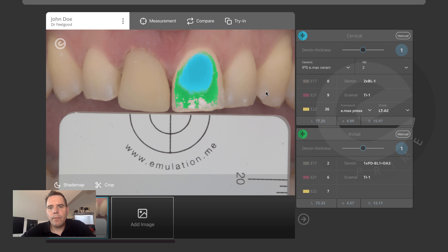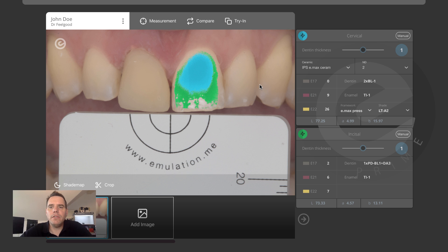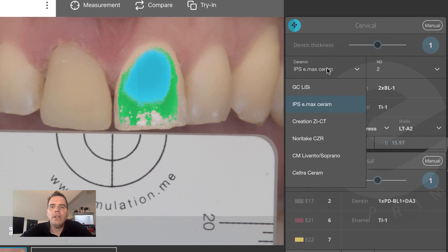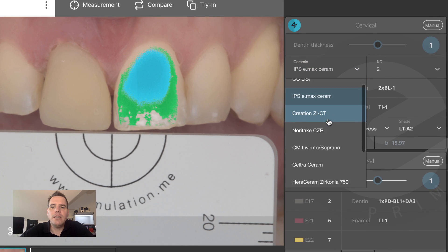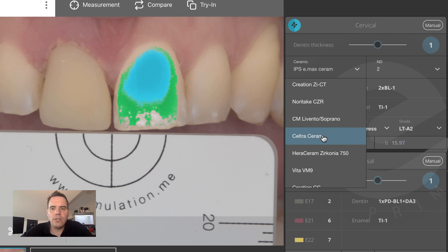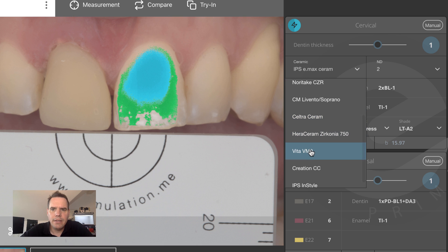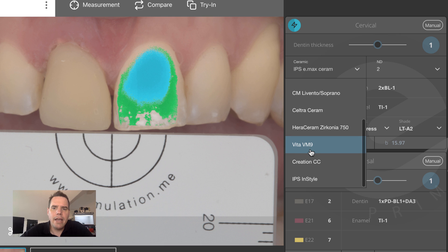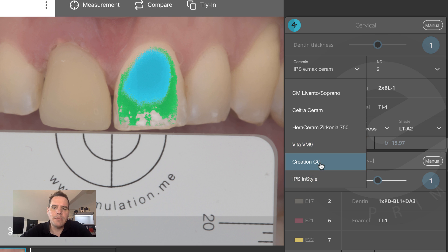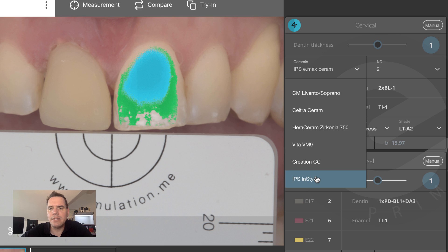So what's new in Prime? What is new in this version? Well, we have built in a couple of really cool new features. The first thing is easy to find — you just click on the ceramic drop-down menu and you will see immediately that we're now supporting a bunch of new ceramic systems, including the Celtra Ceram, the Vita VM9, and now also two metal ceramic systems: the Creation CC and the IPS InStyle.